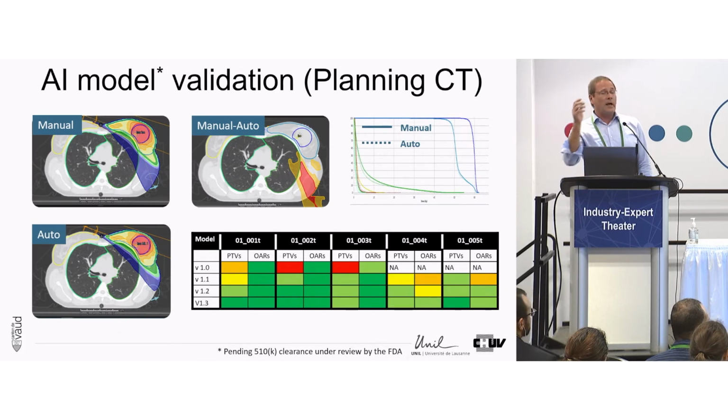So we researched and developed a model for auto-calculating the dose with an AI tool. And you see there the differences in particular.